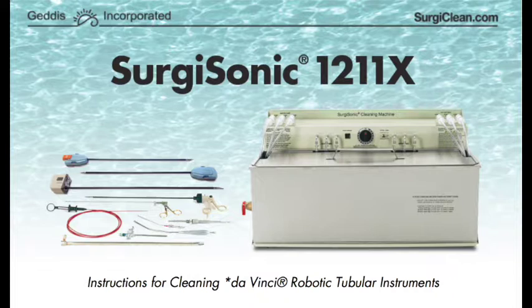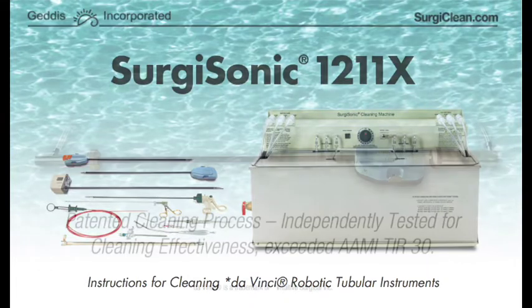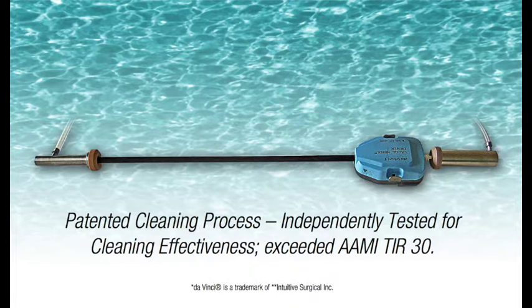Surgisonic 1211X in service for cleaning DaVinci robotic tubular instruments. Our patented cleaning process, independently tested for cleaning effectiveness, exceeded AMI TIR-30.